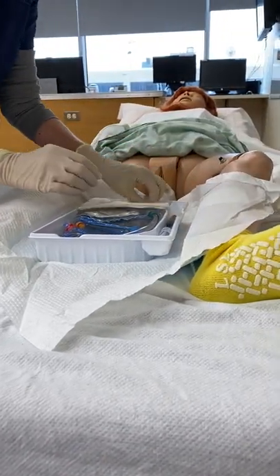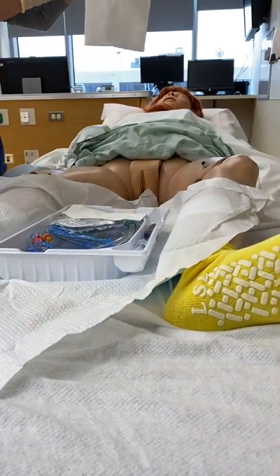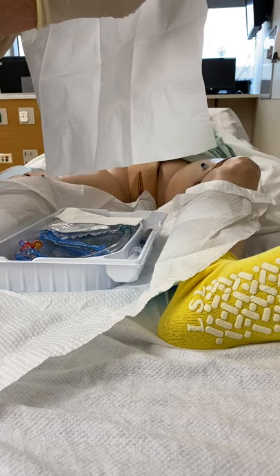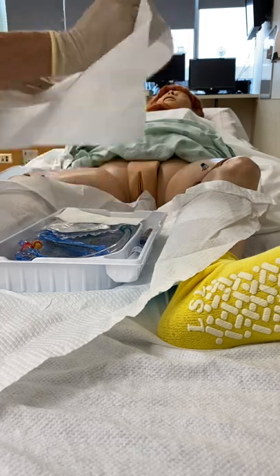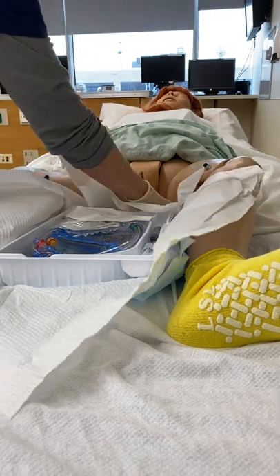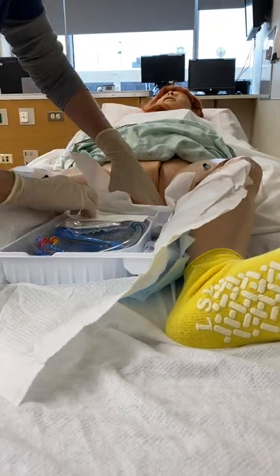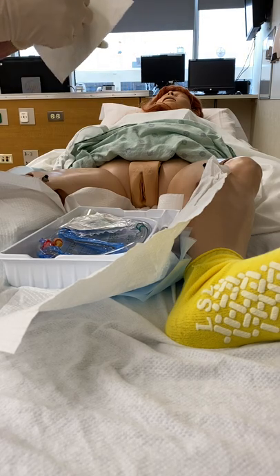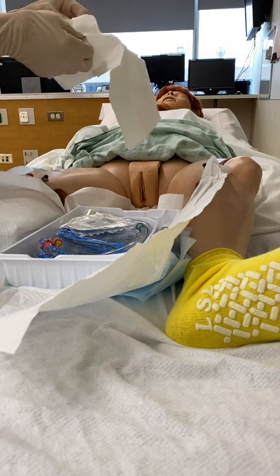Now we're going to put down the sterile drape — shiny side down. I always take it by the corners and put it under so that I don't touch the patient's skin. Then there's a fenestrated drape. Some people don't use that, but for this we will.